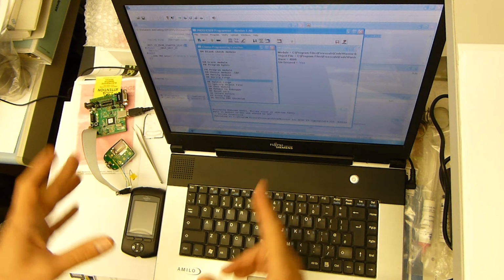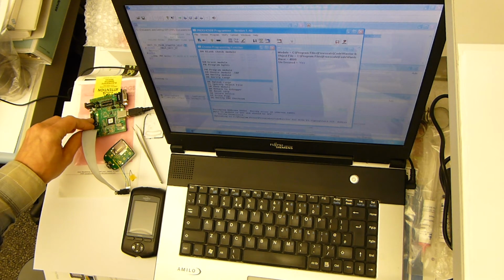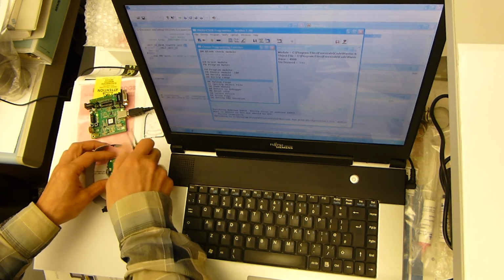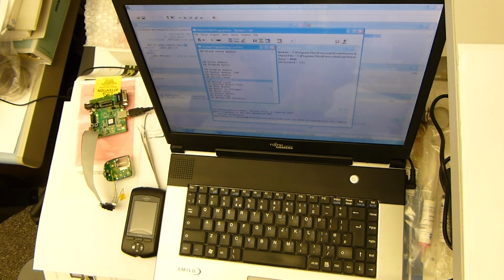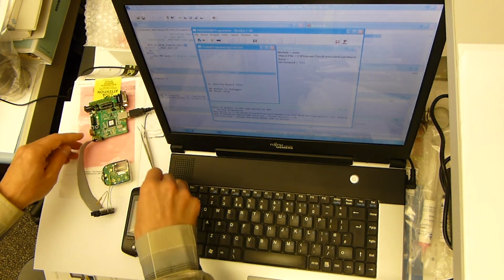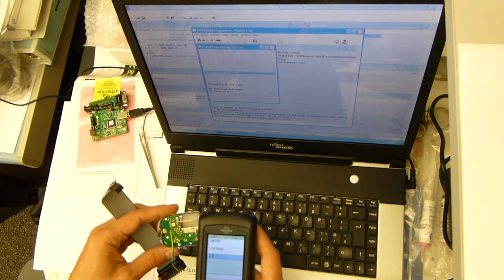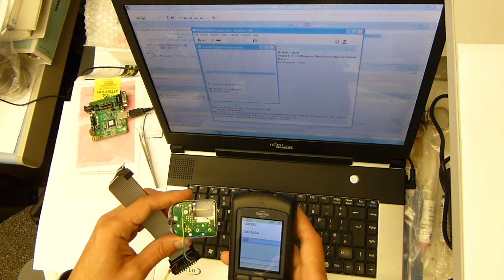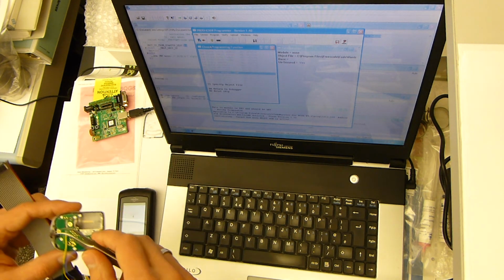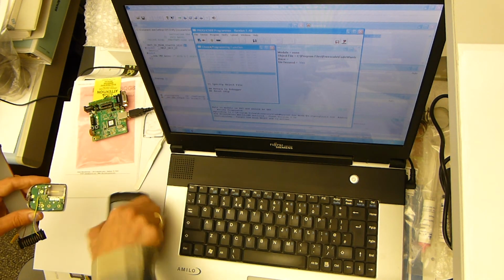Unfortunately, once you access the firmware, the pod can no longer be used. So if we disconnect the pod from the programmer, it will no longer operate. If we reset it, it will not respond to the PDM controller. You see, there's a communication error. And if we try to reset the pod, it will go into constant beep.